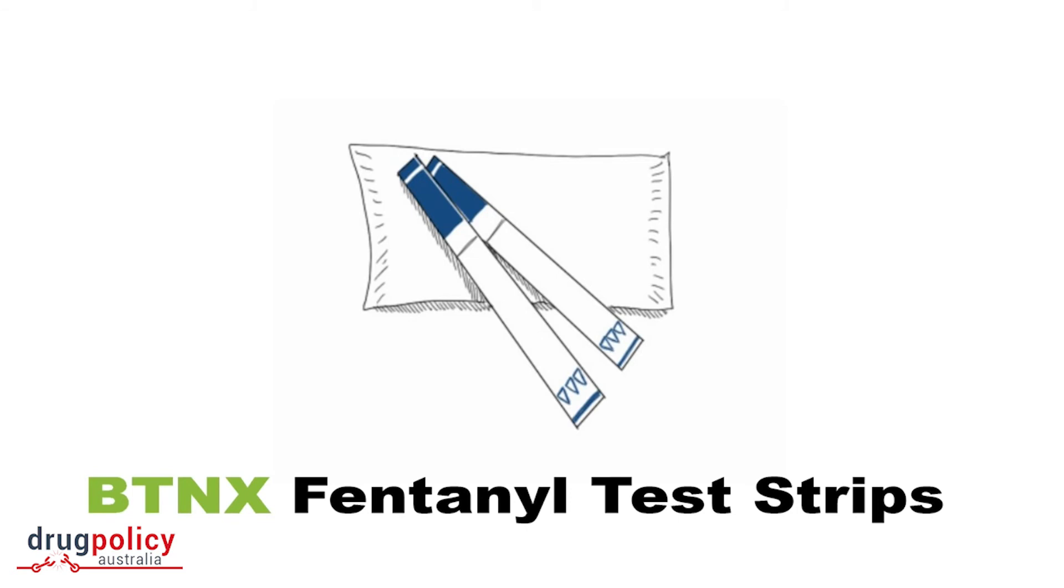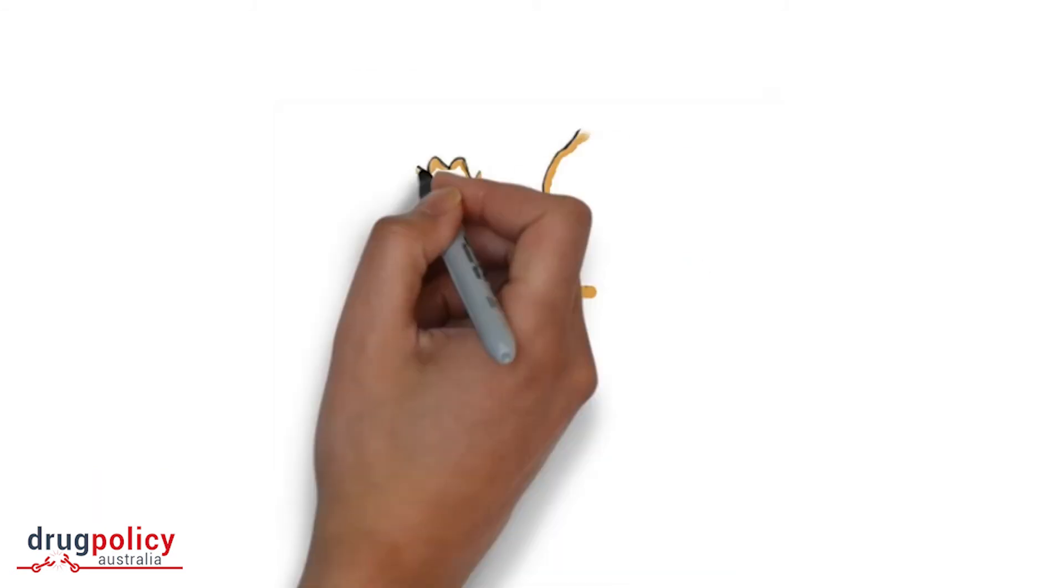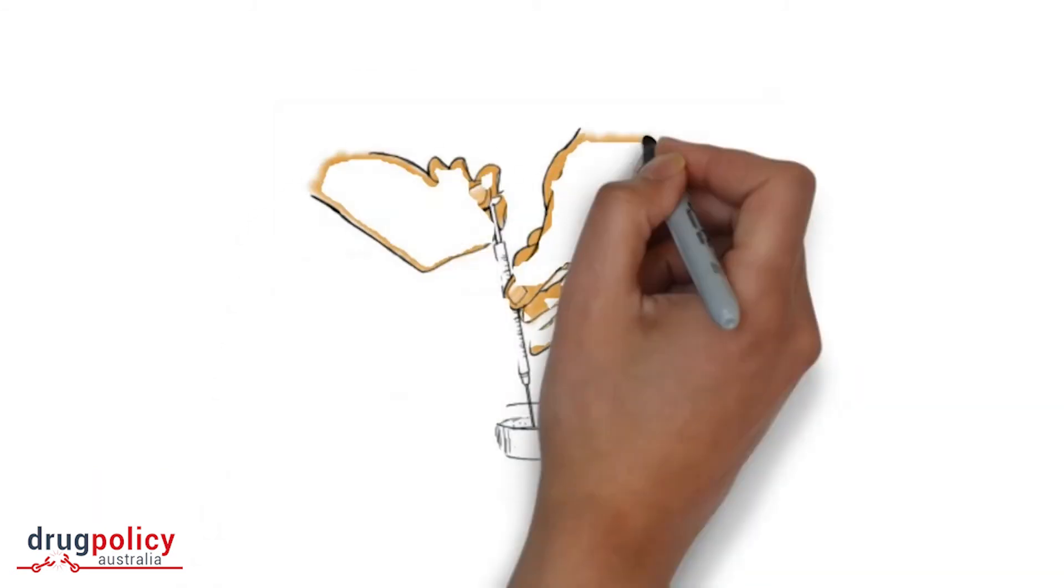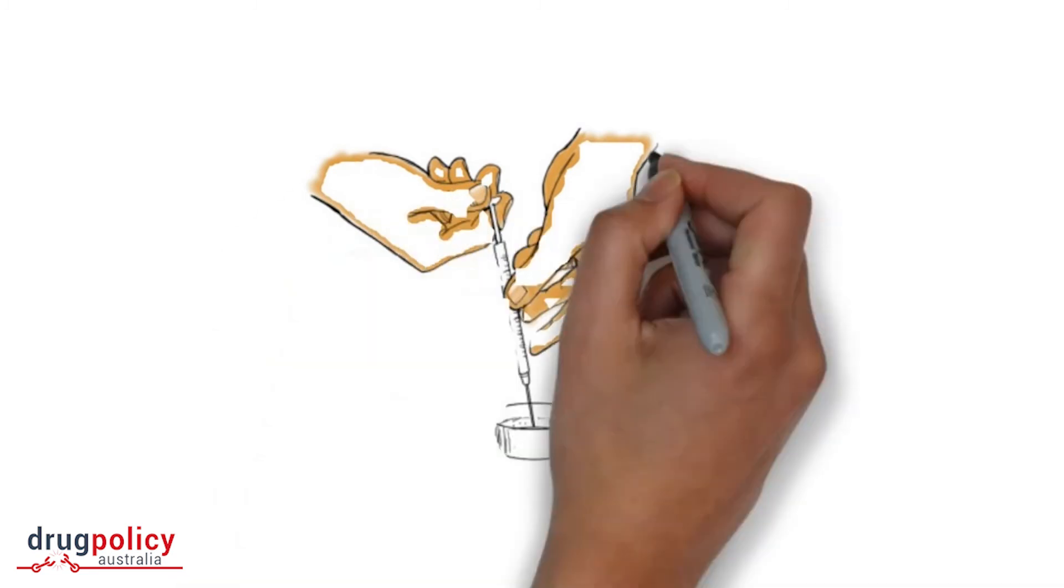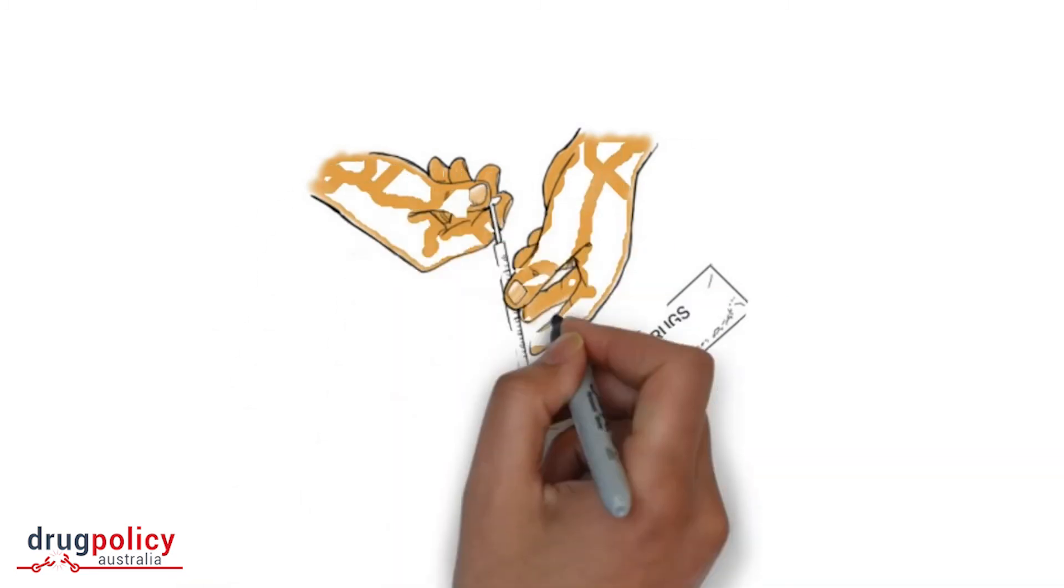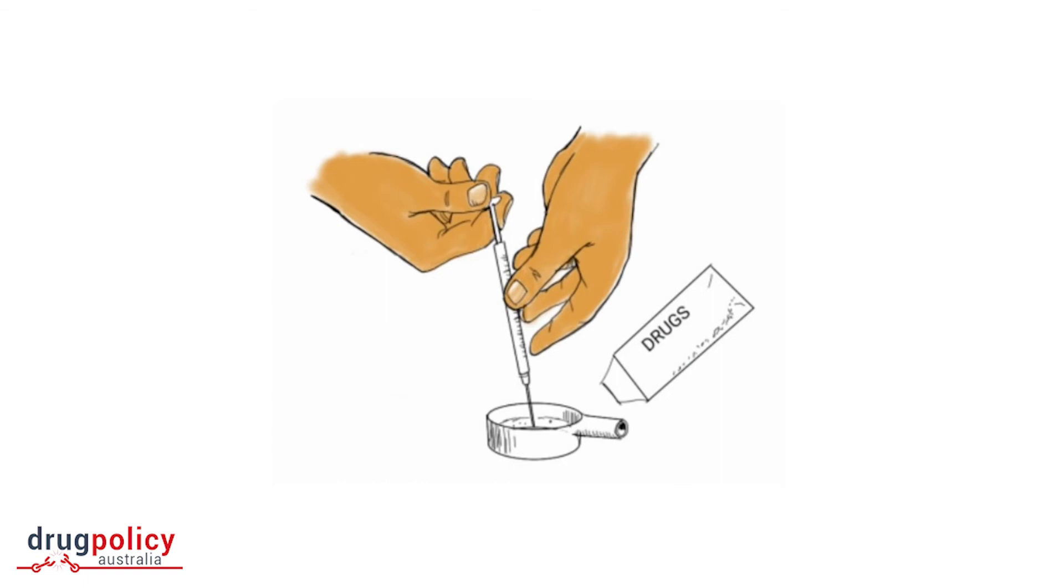Let's say you have some drugs you are going to inject. Prepare your shot as usual, making sure to use a sterile never used before cooker as well as a sterile syringe. Draw your shot into the new syringe and set it aside.